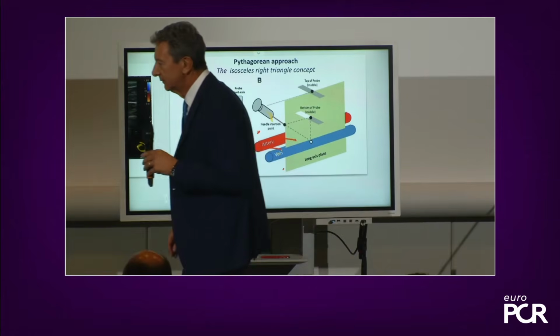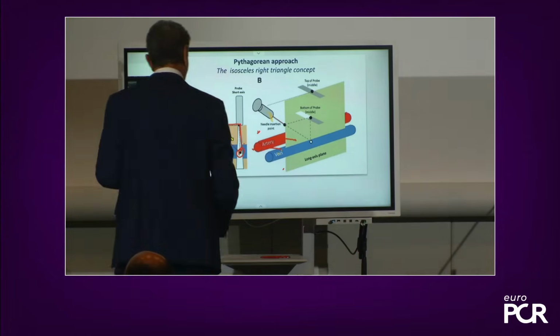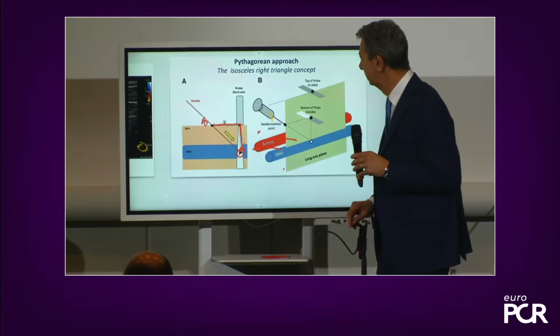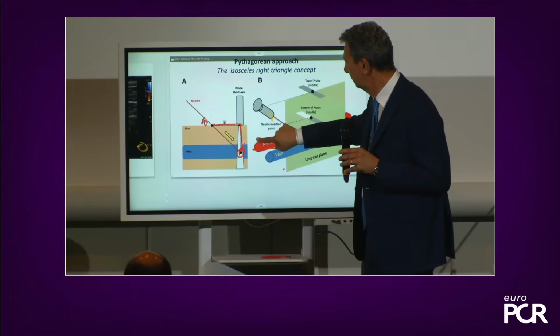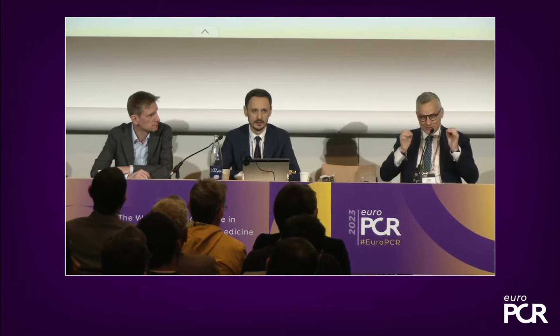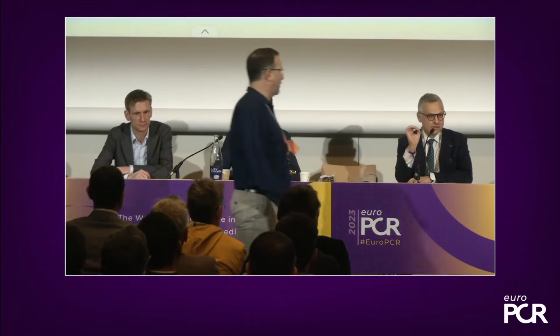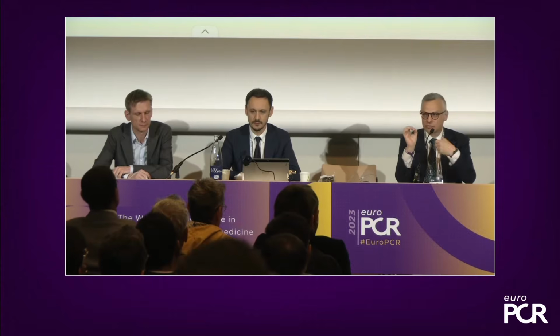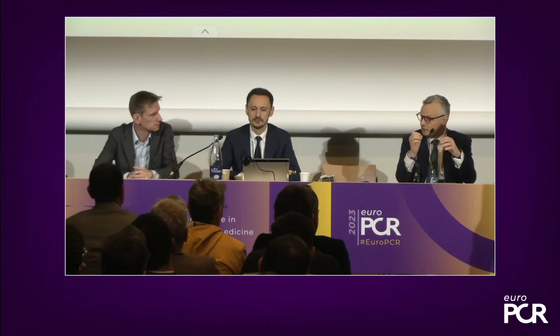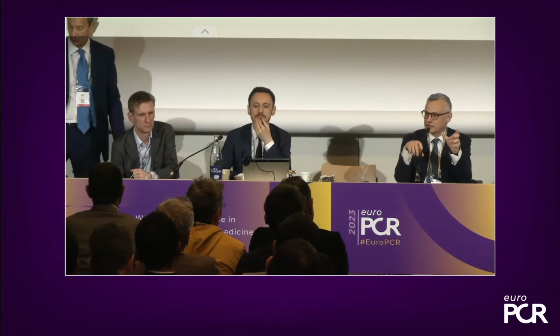I think, before we go on, once more, I want to stress one point. I see a lot of colleagues who have the echo probe in the left hand and then try to puncture without seeing the needle. If you use the probe, you need to really identify the tip of the needle. This is not easy, it takes some time. You have to scroll with the left hand several times, but you need to be very sure that you are going to puncture the anterior portion of the artery, and as we have heard before, distant from the bifurcation.